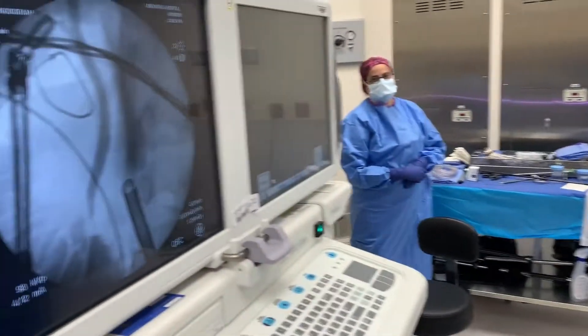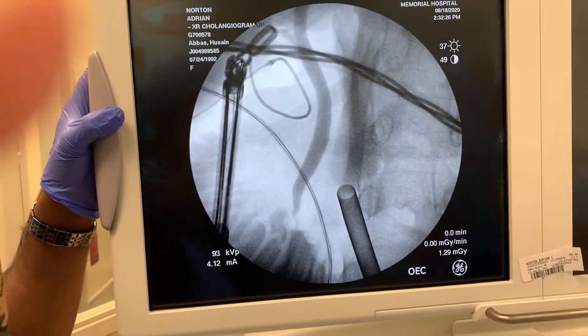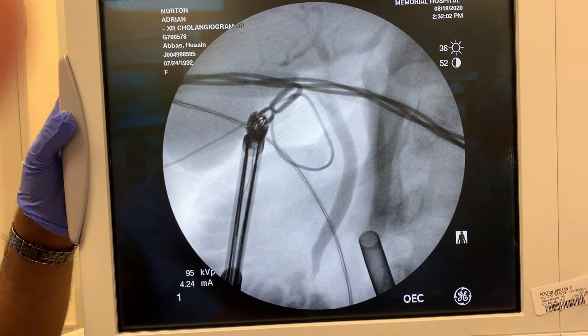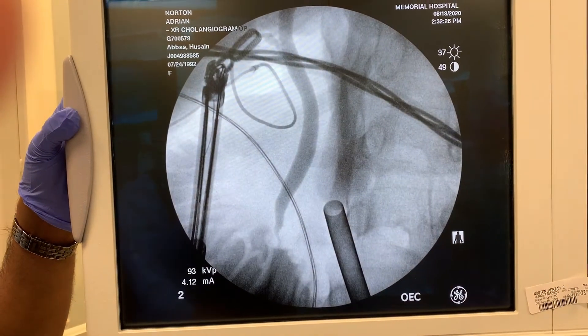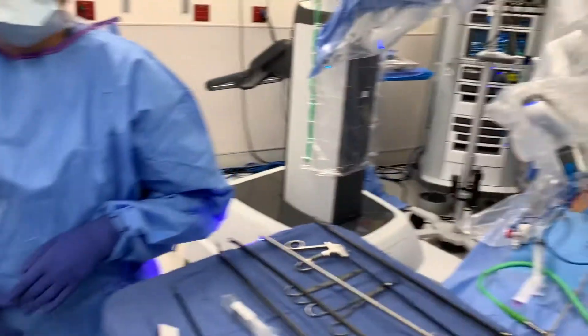And here's what the x-ray showed — this shows the common bile duct. We also had a couple of better images of the right and left hepatic ducts as well.